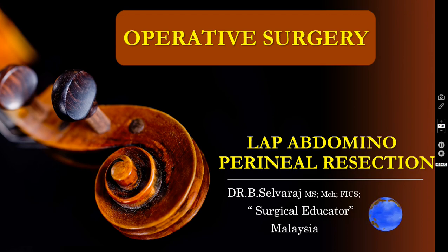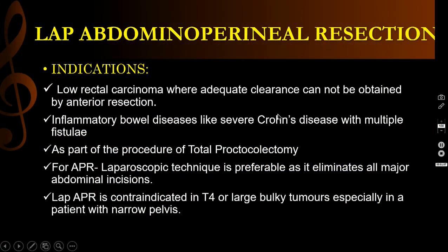So, in this episode today, I am going to discuss one more operative surgery video, that is on lap abdominoperineal resection or lap APR. So, what are the indications for lap abdominoperineal resection? It is the low rectal carcinoma where adequate clearance cannot be obtained by the anterior resection. This is number one indication.